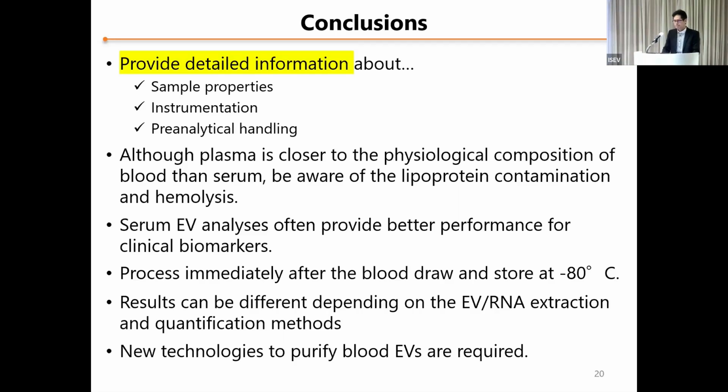Thank you. We have some questions online here. First question: is serum or plasma better for microRNA biomarkers in non-cancerous samples? It depends on the aim of the study, I guess. What is your thought on a setting to check non-cancer patient samples? Let's see.